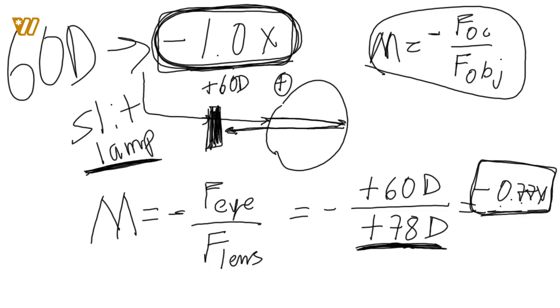I think the key picture, whenever you step back and think, okay, what is the key picture with fundus lenses? It's this. Whenever you increase your fundus lens power, so you go from a 60 diopter lens to a 78 diopter lens, right? What happens? You get lower magnification and increased field of view, all right? And then the other key piece of information you need to know is that a 60 diopter lens creates a minus 1x magnification, okay? So it doesn't magnify, it doesn't minify, and so you can actually directly measure the height of the optic nerve using a 60 diopter lens.